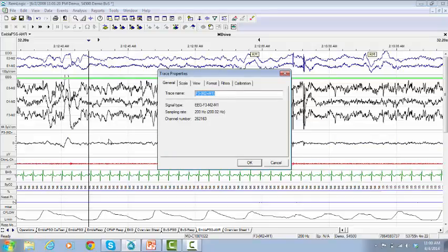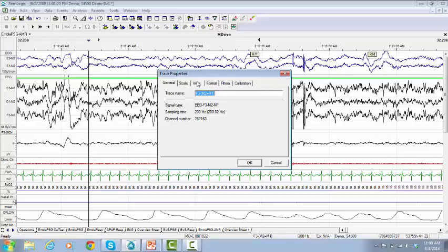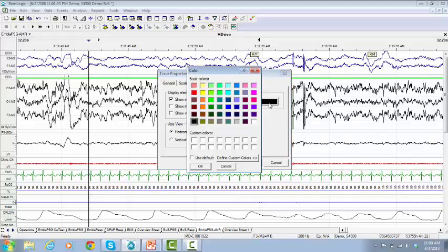The Trace Properties window will pop up. Go to the tab View. On the right upper corner, click on Color and select your preferred color. Click OK.